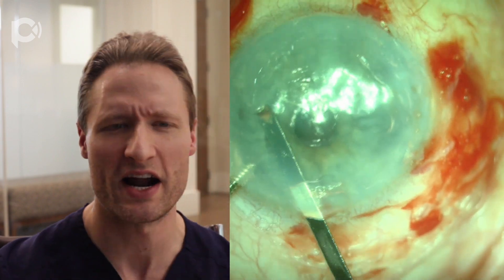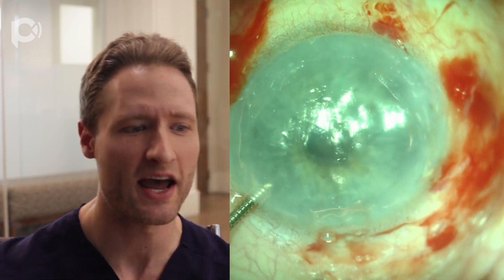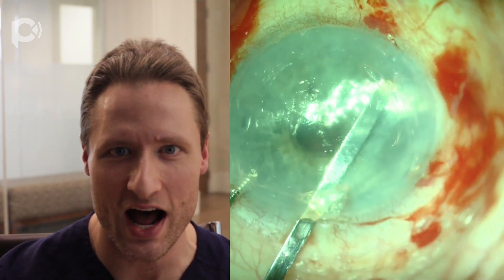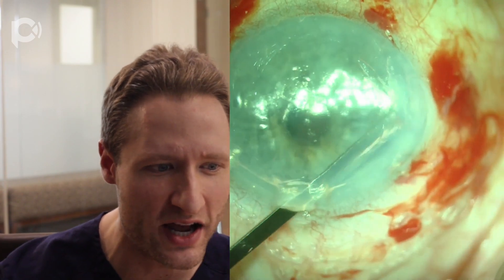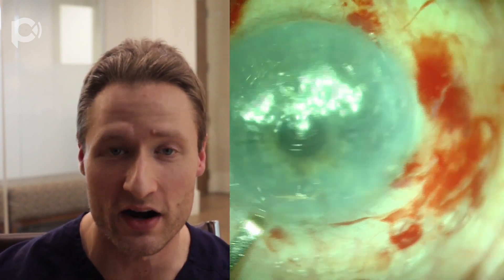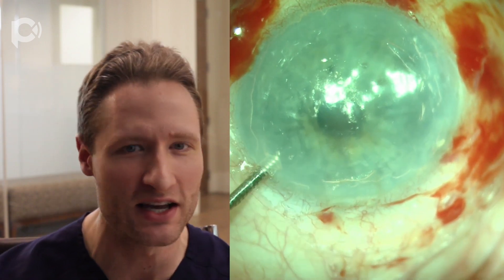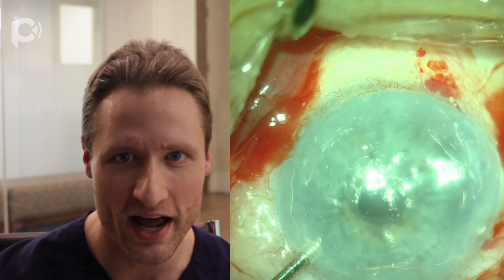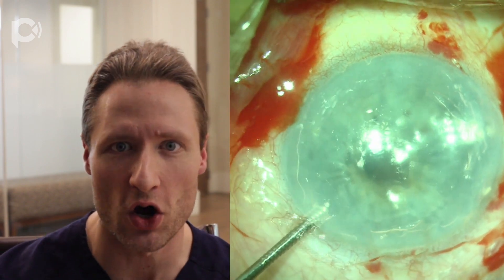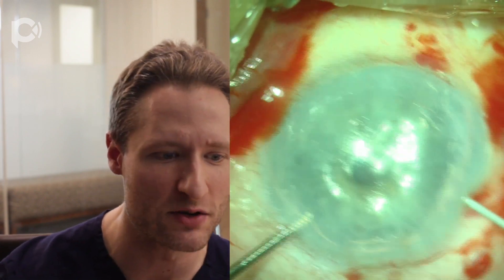Meanwhile, I'm still preparing the posterior cornea for the new endothelial cells, meticulously scraping all of the little debris left over from the old DSEK graft interface. This is your only chance ever to remove it — if you don't remove it now, it'll be there forever. So it is so much better to take your time and get it out. Once you've contented yourself that you have removed all that you can from the posterior corneal surface, then it is time to make the iridotomy.